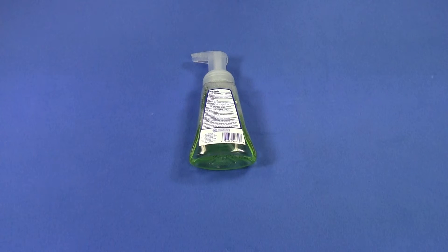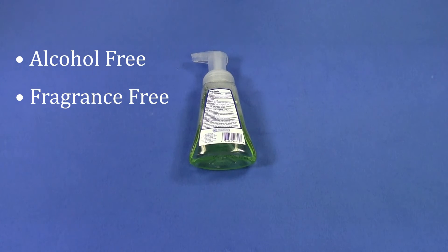Prior to attaching sensors, I may ask my subject to clean their hands so that they are dirt free. When doing this, I want to make sure the soap they use is alcohol free, fragrance free, and dye free. For the same reason as before, alcohol will dry the hands and diminish the EDA response.